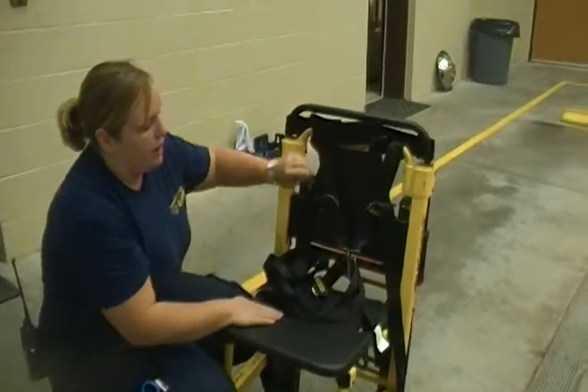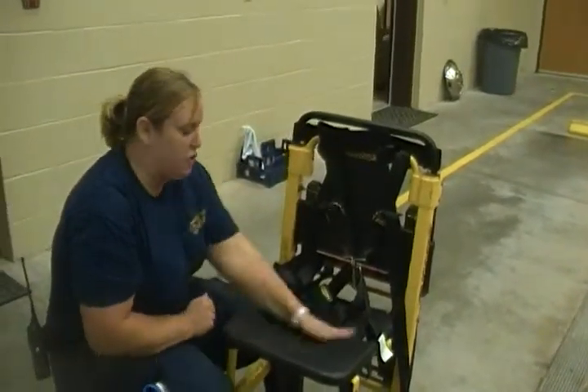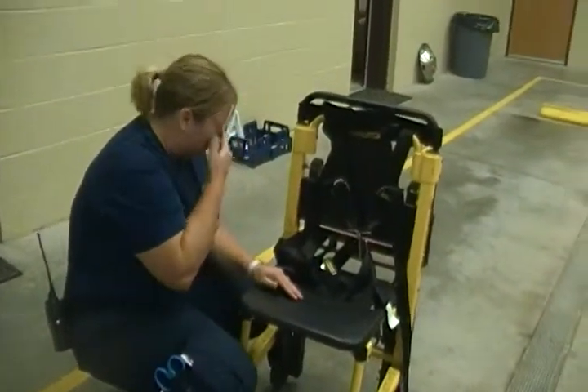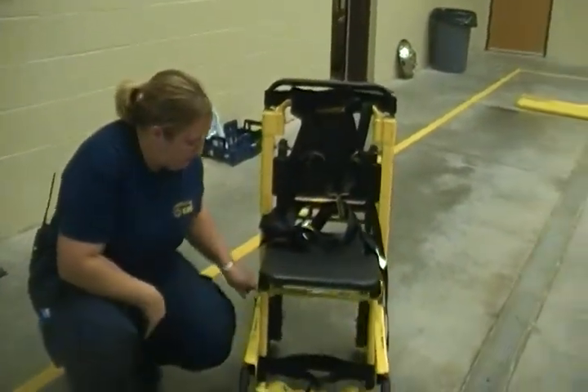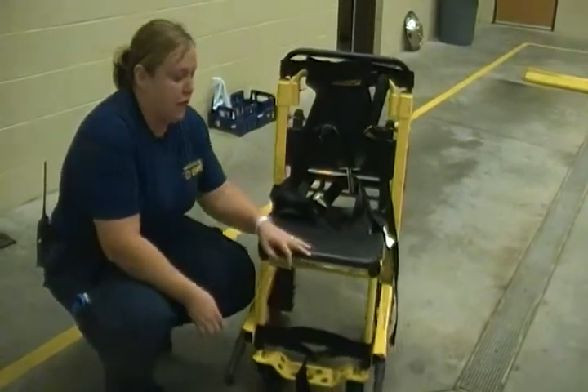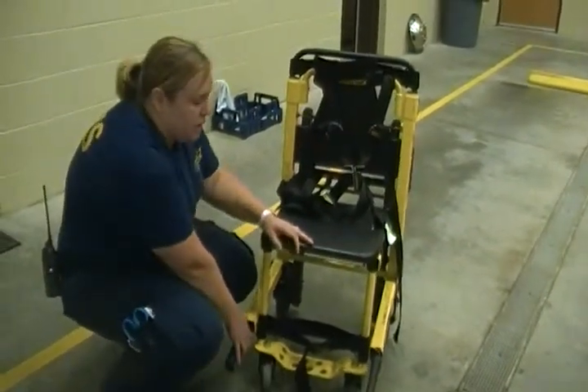Here you've got the backrest and this contoured seat that's used mainly for patient comfort. It says it's a max weight of 400 pounds, so if they're any larger, it's not a very good device for that.